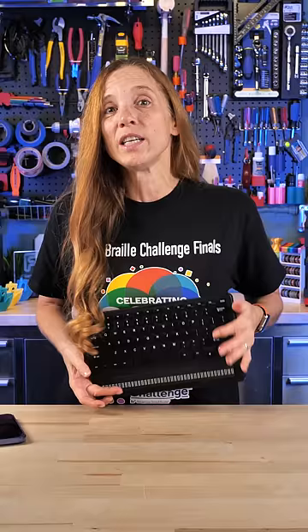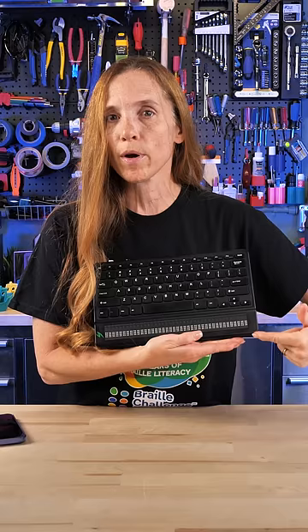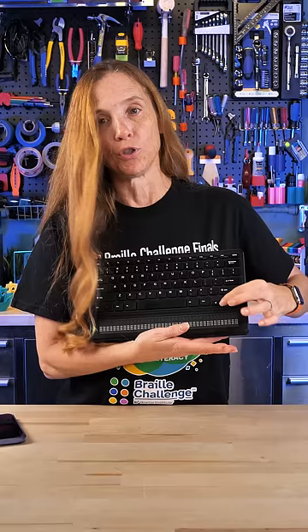You've probably seen Braille before — this is my daughter's choir music. But have you seen a refreshable Braille display? This is the one her school system got for her. It has 40 Braille cells at the bottom, and they change up and down every time she moves up and down.